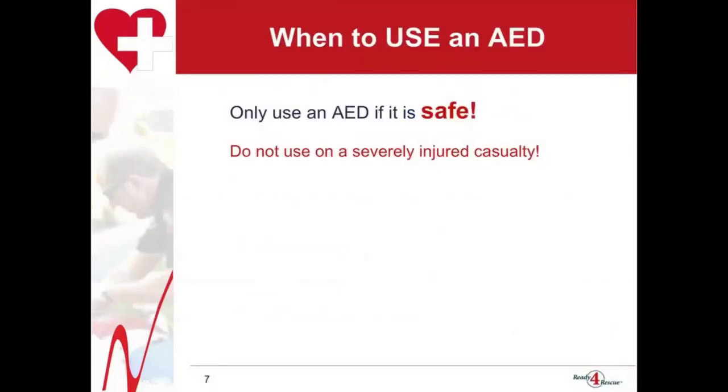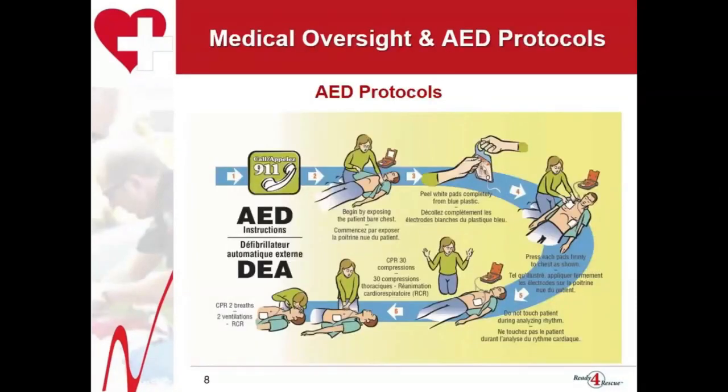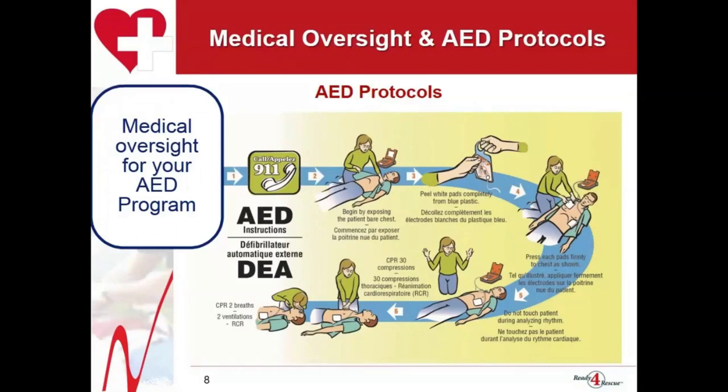You only use an AED when the environment is safe. Do not use it on a severely injured casualty, and only attach an AED on a casualty that is unresponsive and not breathing normally. HeartZap Services provides medical oversight for your AED program. AEDs are designed to determine the best treatment for a casualty.